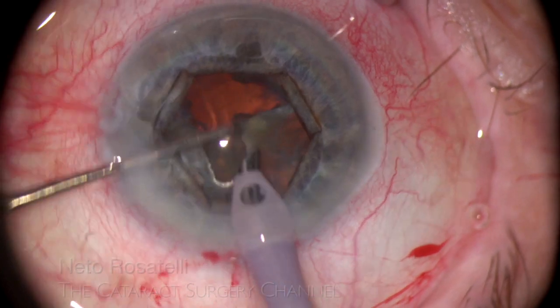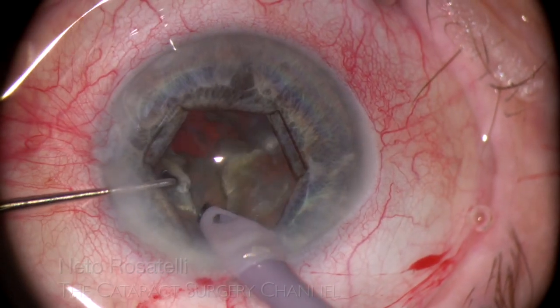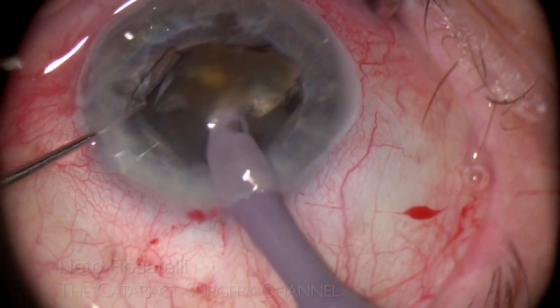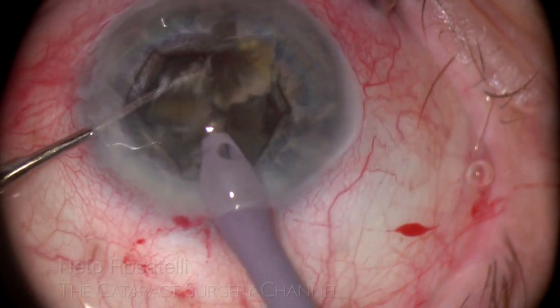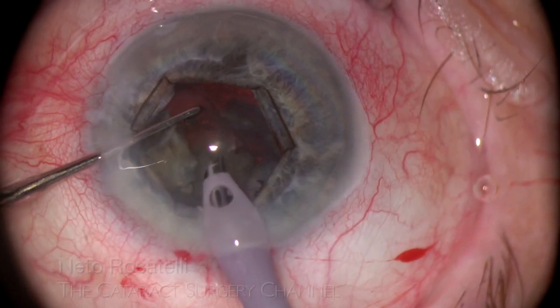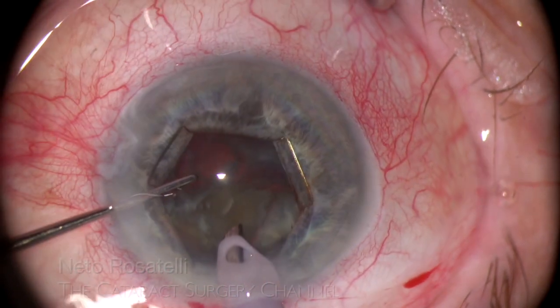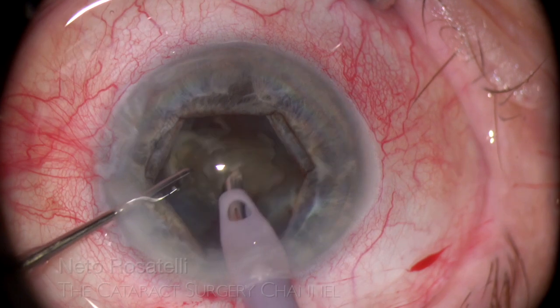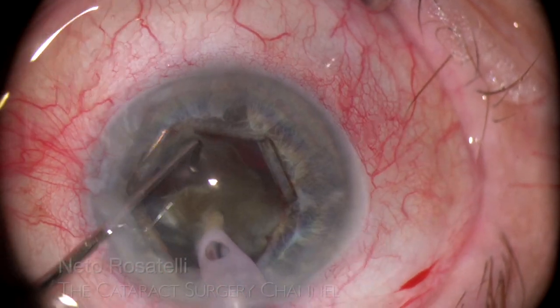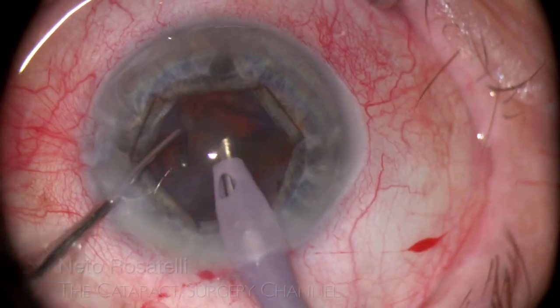As a whole nucleus quadrant has been emulsified, its vacant space provides easy and better visualization. I prolapse this big piece half out of the bag and proceed by chopping and emulsifying it in the safe zone, avoiding working inside the bag. The rest of the nucleus is approached the same way — by engaging and releasing the pieces from the capsular bag and carefully emulsifying them. The pieces must be chopped down to a small enough size to be able to rotate and safely be emulsified.